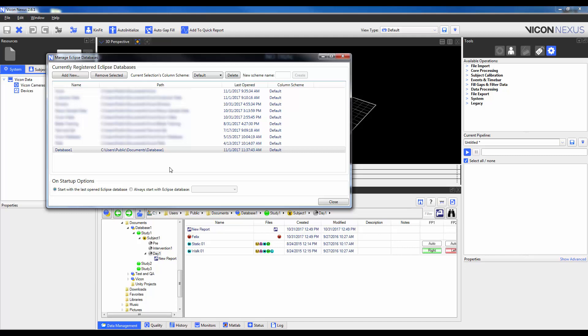To create a new Column Scheme, simply type a name into the New Scheme Name box, so I will type in Custom, and then click Create. We can see here that whichever database was highlighted below will be automatically allocated with that Column Scheme.